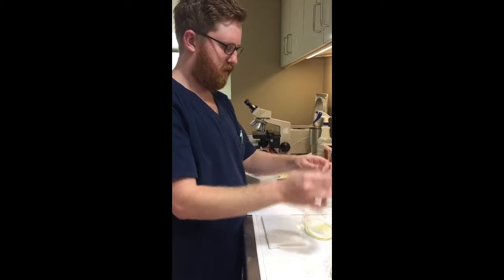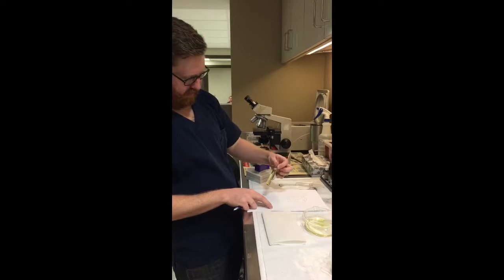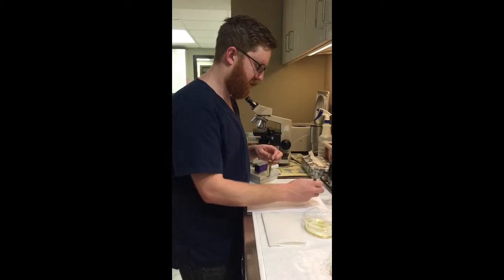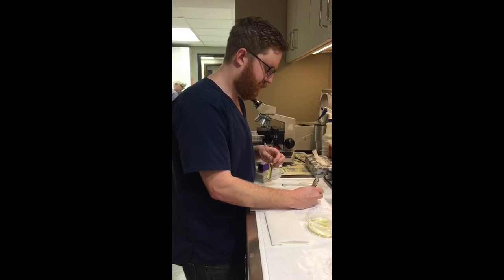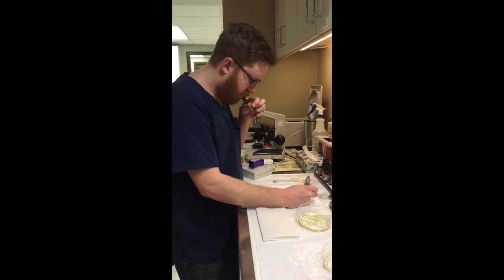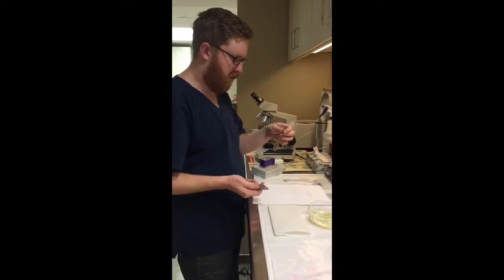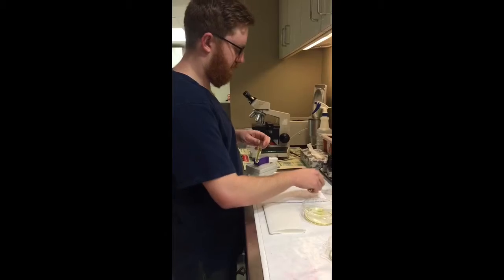So I've got about 10 ml here, and I'll go ahead and record the color. I can see straight through it. I can read the chart here perfectly through the urine, so I'm just going to put that it is dilute yellow. And it was a free catch. As far as odor goes, there's really almost no odor to it at all. So, it does seem like it is going to be a light sample.